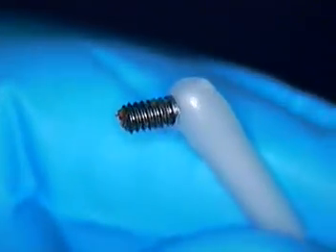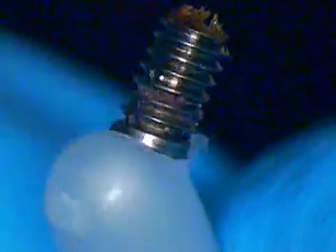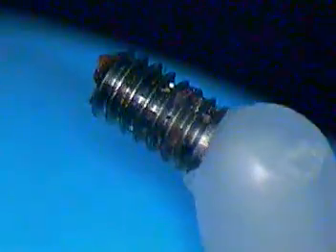Now just inspect the threads and see all the bioburden that's on it. So we've got to clean all that out. Most of that's inside the fixture. But let's look more closely. You can actually see some aberrations in the thread. Yeah, that's how big it is. All right, so it's a whole lot of havoc. But you can kind of see the burden, which is debris, basically. It got caught down in the threads. Okay, so here we are. Without them, the rest of it is routine.